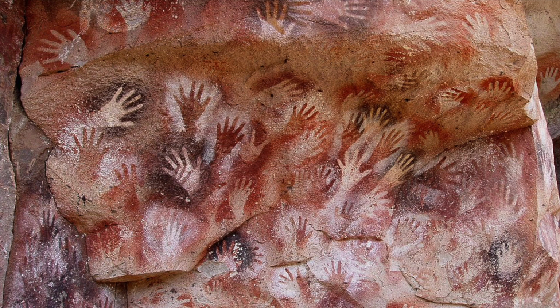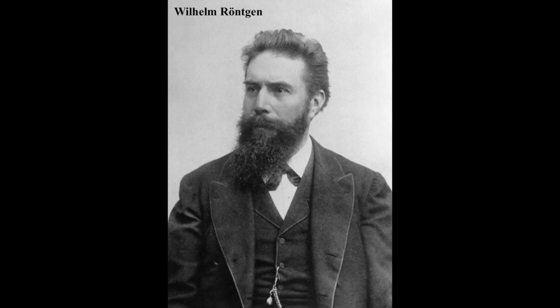Now I'd like to talk a bit about the history of how X-rays were discovered, because it's a good byway into explaining how X-rays are generated and what they're used for in medicine. So in 1895, a physicist named Wilhelm Röntgen discovered this type of radiation. As I said before, he didn't know what it was, so he just started calling it X radiation, X meaning unknown. And Röntgen didn't just discover X radiation. He also made the first X-ray image of a human body structure, and he did that in his own home, in his study.